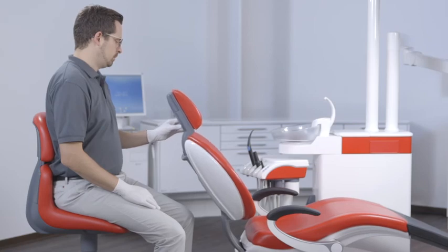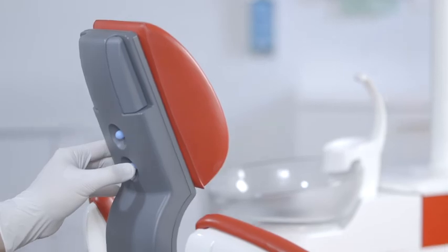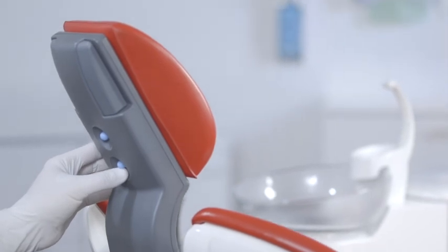Moving the lower four-way foot control horizontally moves the backrest forward and backward. Vertical movement of the lower four-way foot control adjusts the height of the chair.